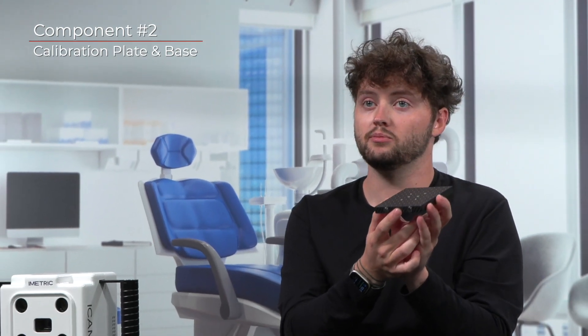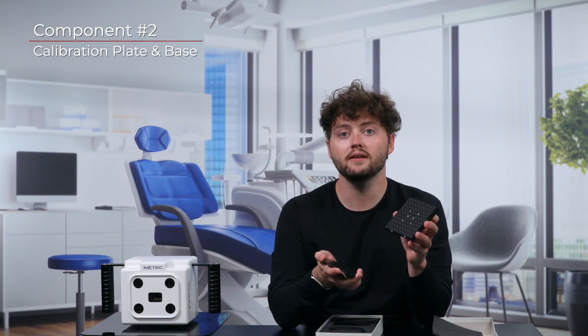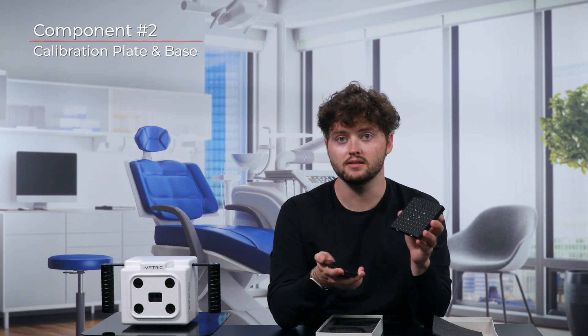Take notice on the bottom of the calibration plate that there are two magnets. On the other side of the box you will find a black metal plate. This black metal plate functions as a base to the calibration plate and allows it to stand upright for the ease of the calibration process. It is important to place the base plate on a steady surface close to the area where the camera will be located.